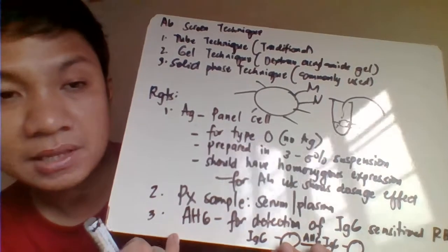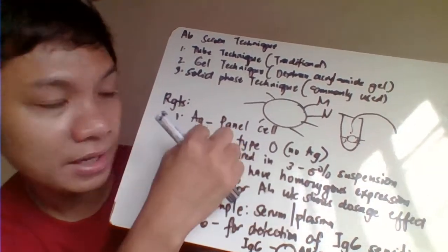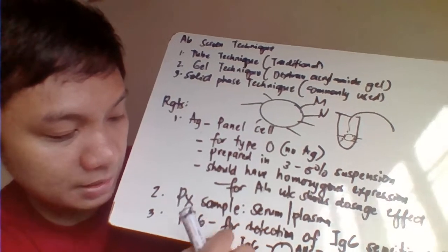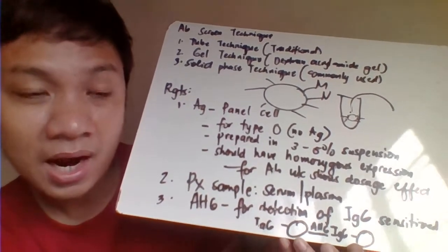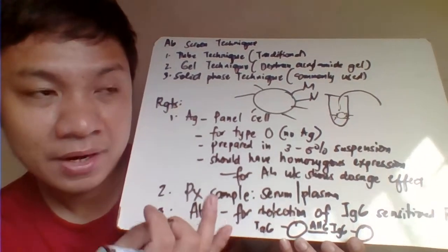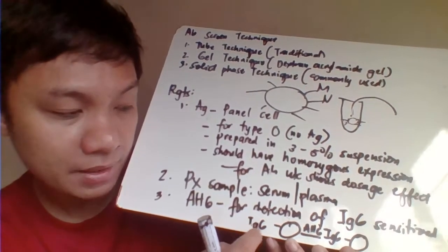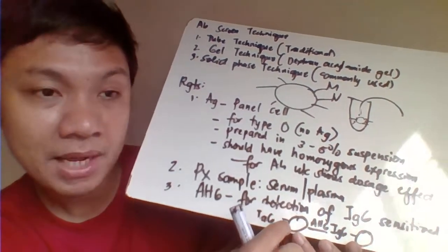Another one is very important here, yung anti-human globulin. So, the anti-human globulin tries to cross-link ang mga RBC natin. Like for example, ito ang RBC natin is your reagent na antigen. Okay, if the patient has antibody, recipient mo, for example, here may antibody na blood group antibody na IgG. Like what? Like pwede siyang Rh, Kell, your Duffy, your Kidd, mga blood group system, those are IgG antibodies. So magbabind dito sa ating RBC ng panel cells natin because dito ay may antigen siya.